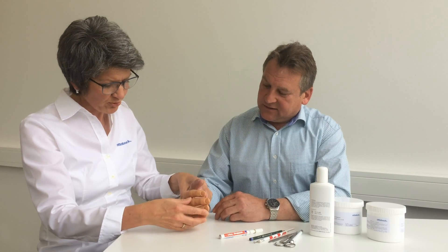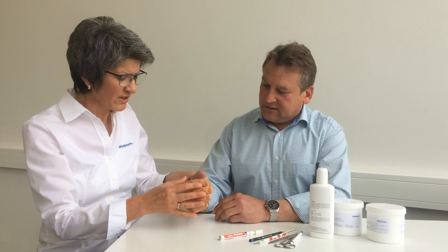Once the prosthesis is on, I check the fit, the position of the fingers, the thumb enclosure, and the proximal socket brim.